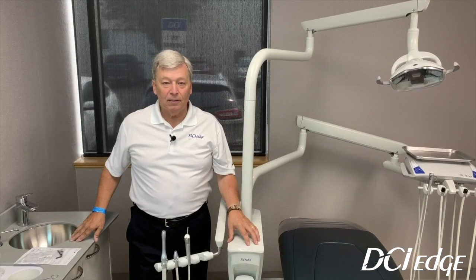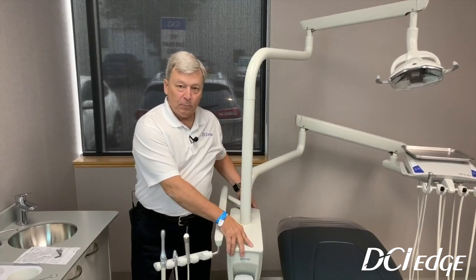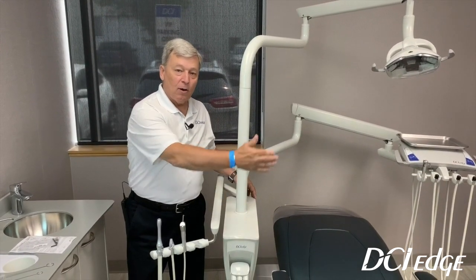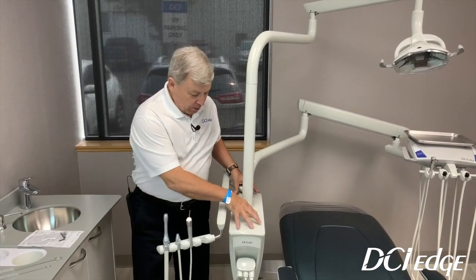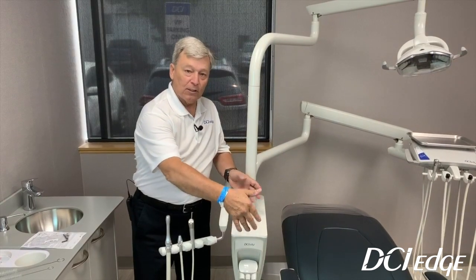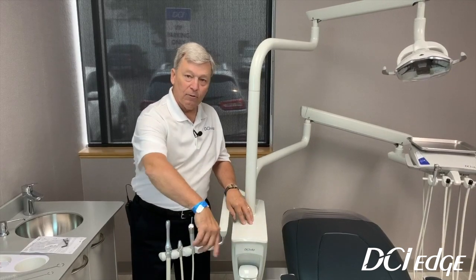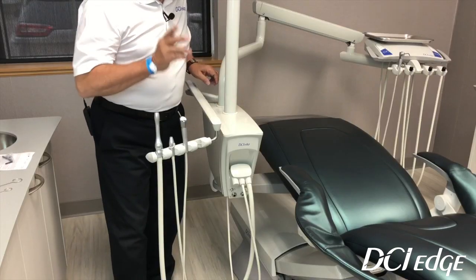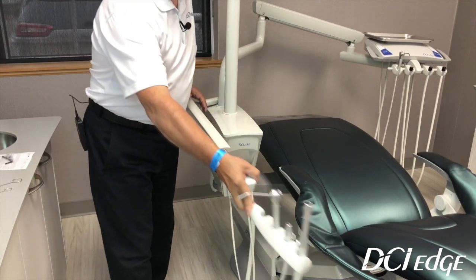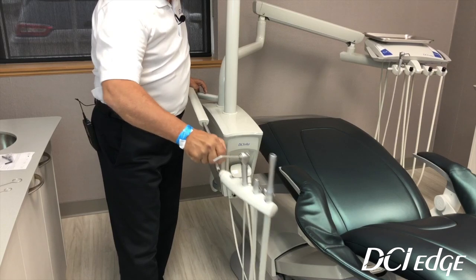I would like to go through the post-mounted Series 5 box that's on the unit. This is a post — it's permanently going to mount either on the right or left of the chair. It is not one of our right-left swing units. This one does not have a cuspidor, but you could also order a cuspidor as an accessory that would come out of the top of the post box for the patient to rinse. Both post-mounted boxes will have a telescoping assistance arm that comes completely out directly to the head of the patient for the assistant to reach.